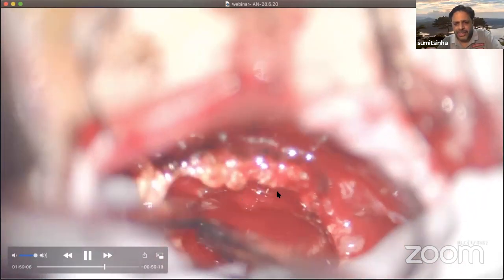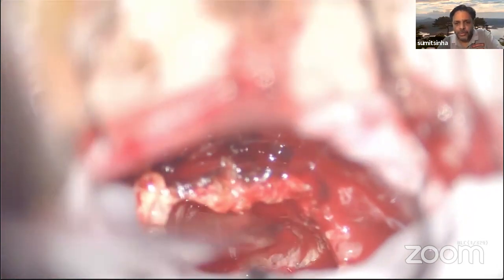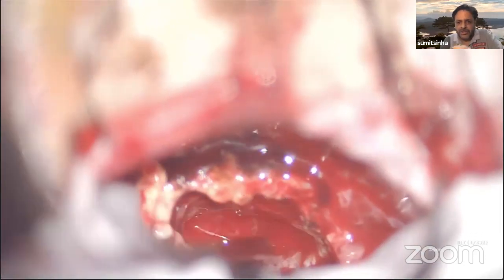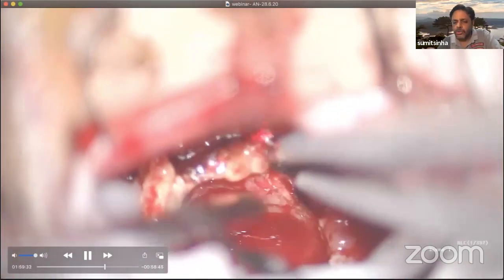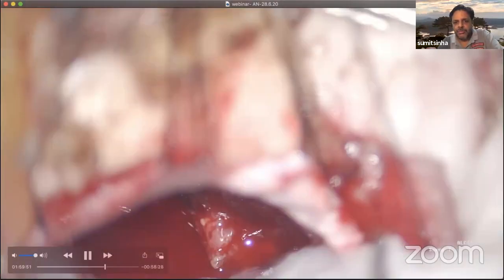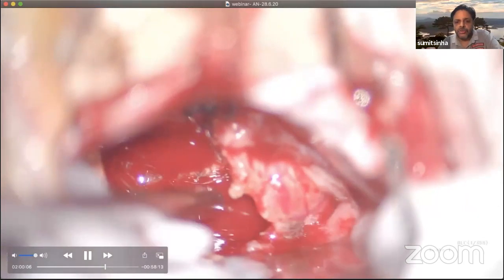Now it is at that point of time that, to answer the question which was being asked before, I prefer to hold my drilling of the meatus till this point, when the tumor becomes more manageable, when I have decompressed approximately 75% of the tumor. Then I prefer to come over to my meatal portion, and if I am drilling the meatus, I choose to drill it at this point of time.